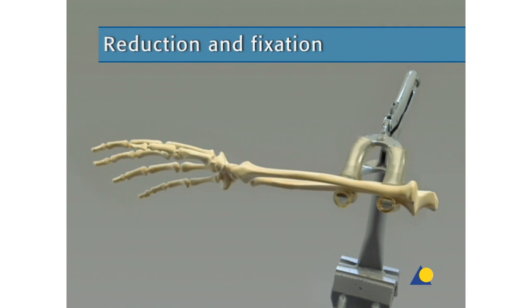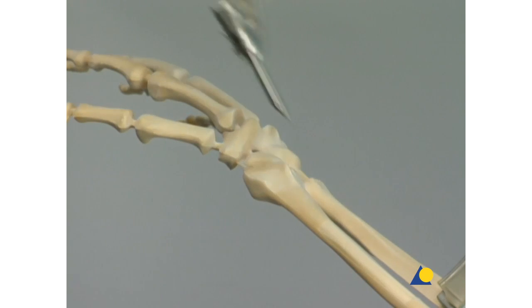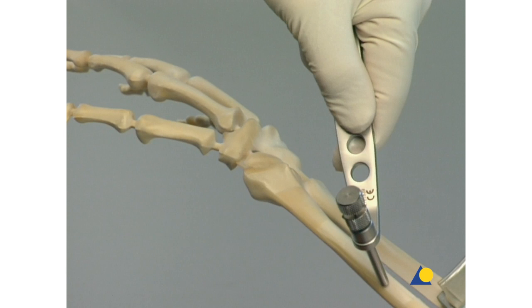The construction of the bridging frame will now be demonstrated. The bone model is secured in the clamp. After a stab incision is made, the drill sleeve assembly is inserted through the incision and placed directly on the bone surface. Care must be taken to avoid the superficial branch of the radial nerve.